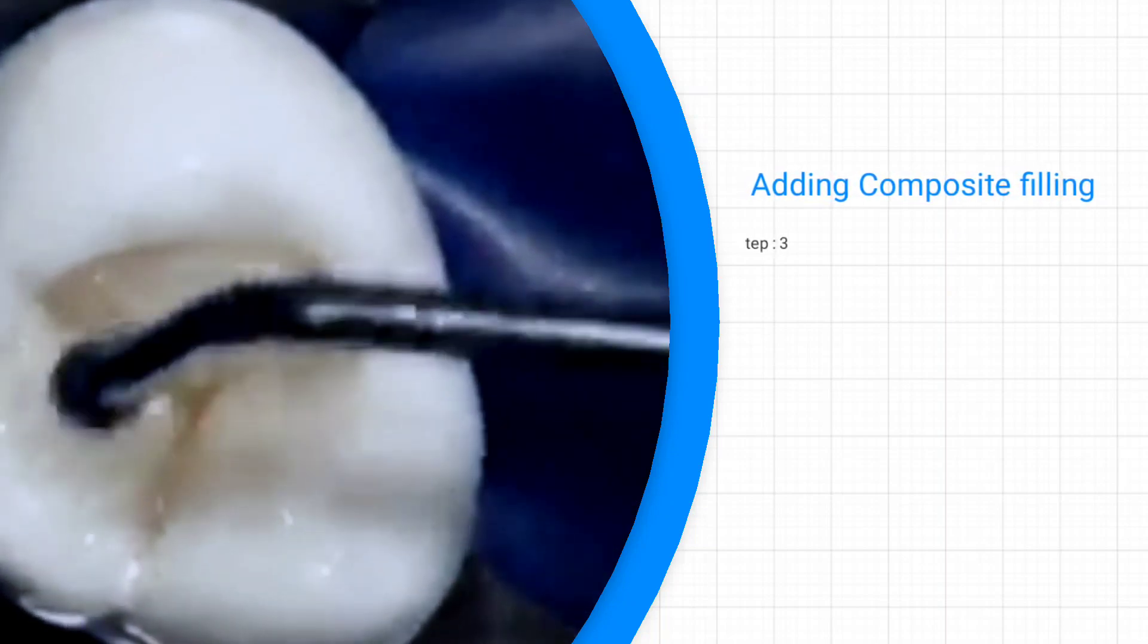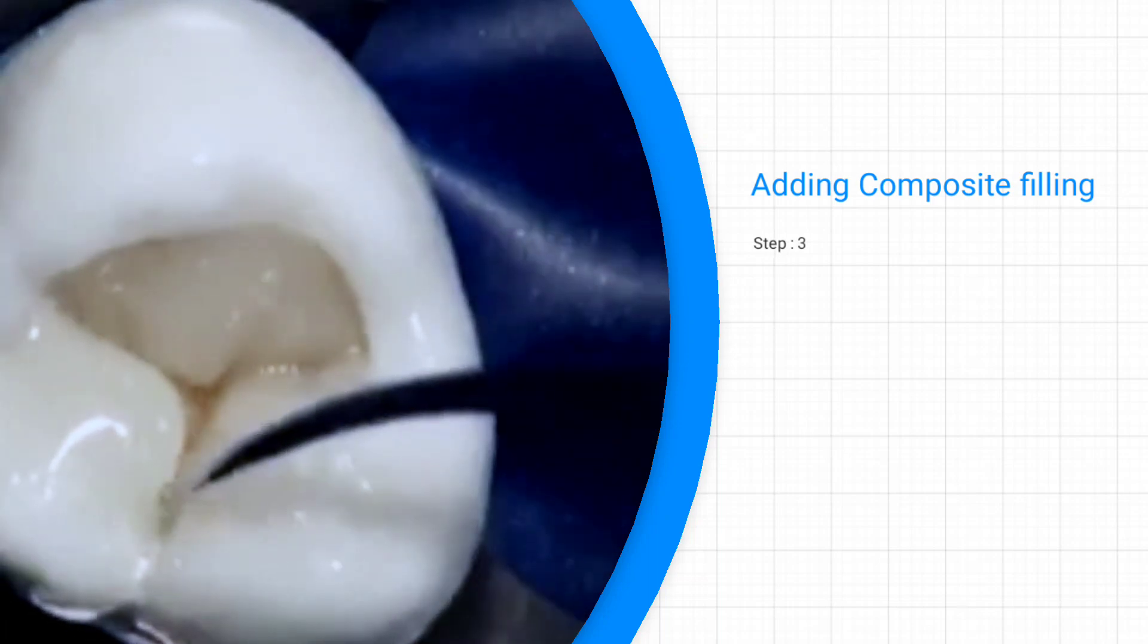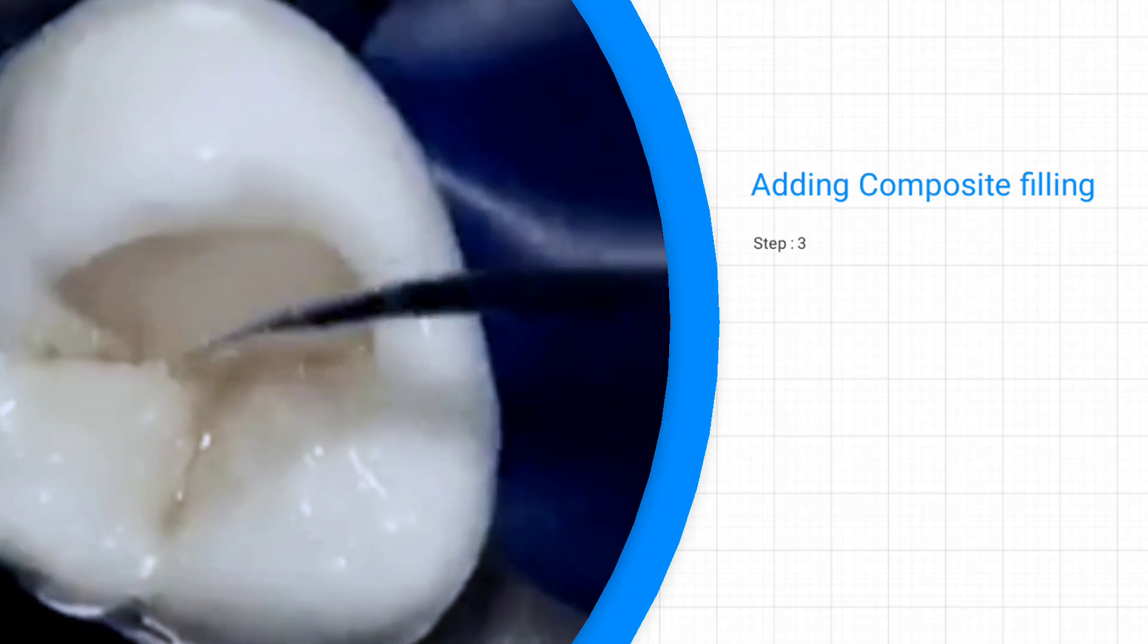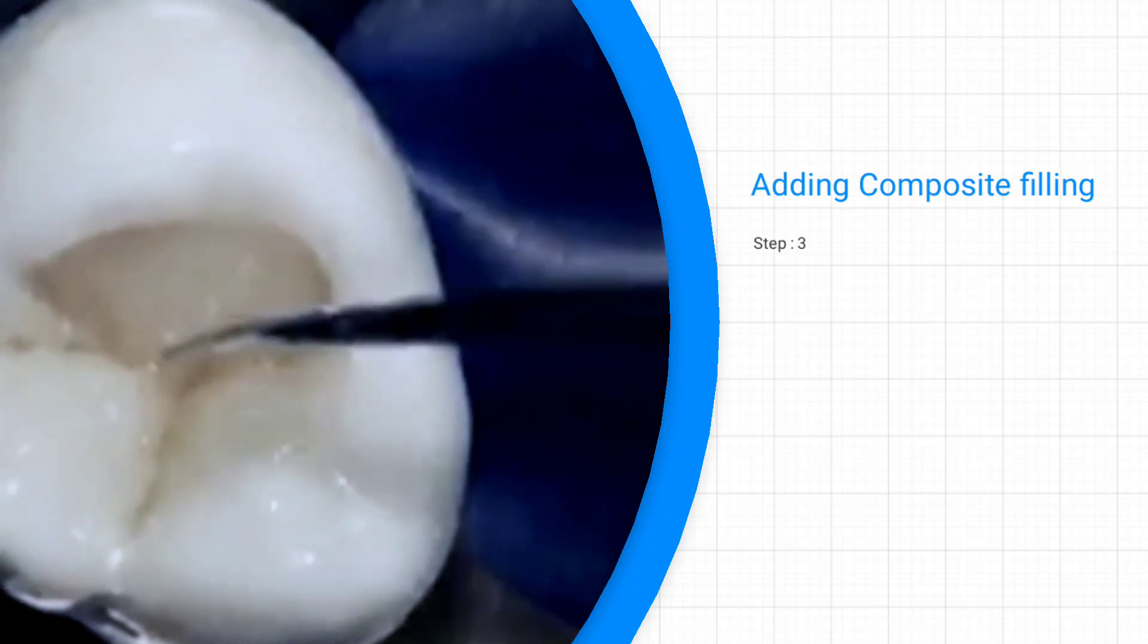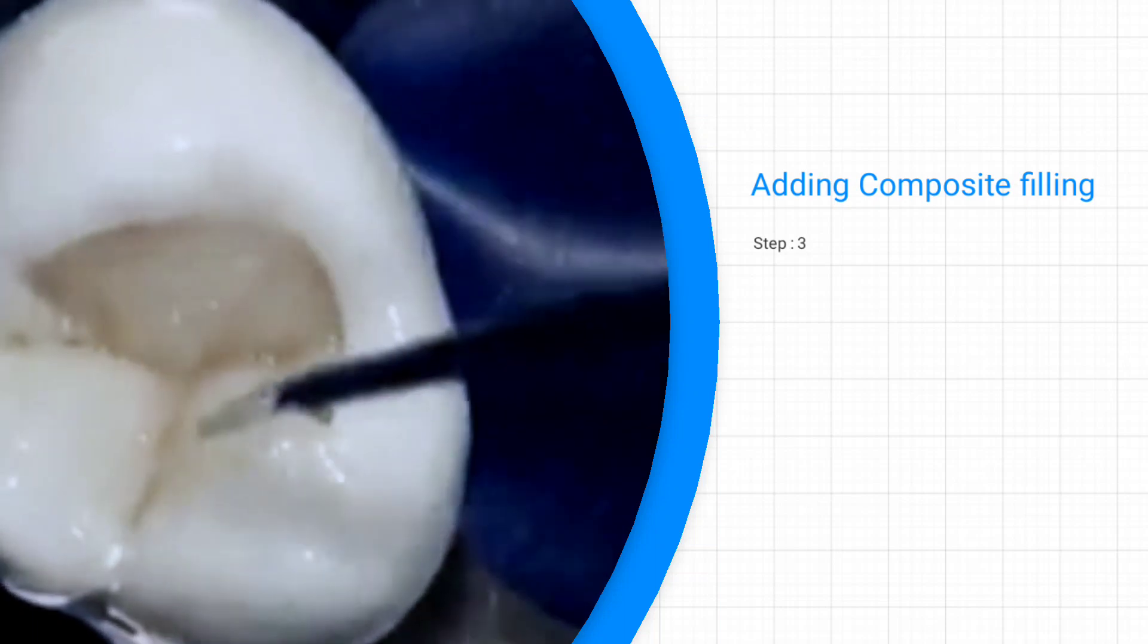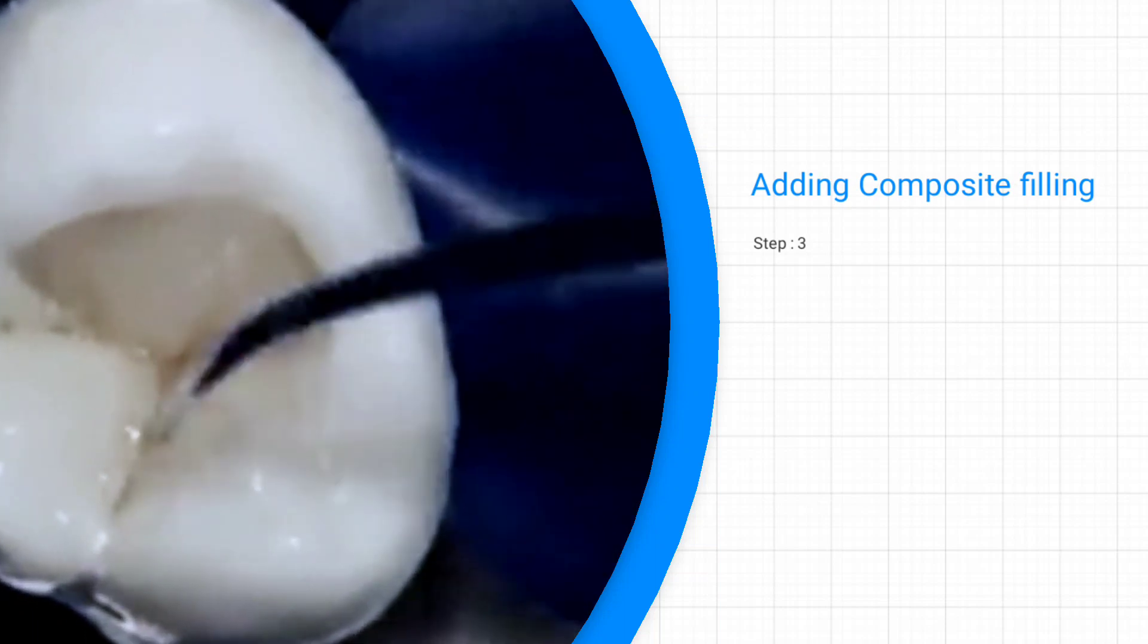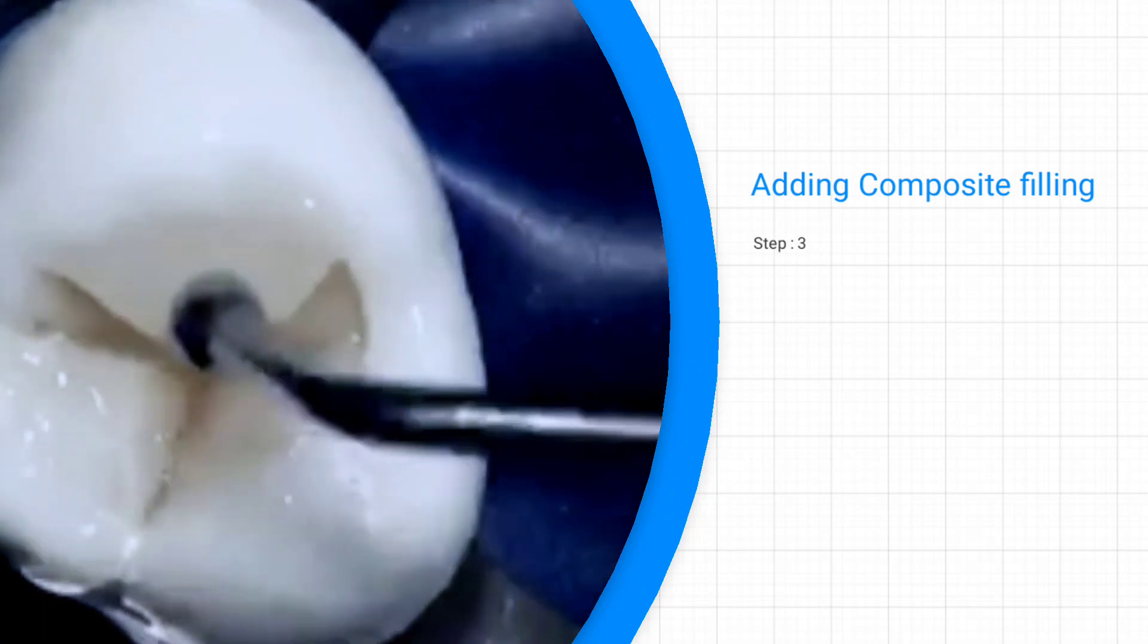Even though the placement of tooth bonding has been completed, it's still very important to check the patient's bite. You need to evaluate how the patient's teeth come together or whether or not the restoration you have just placed interferes with this motion. To do this, you need to place an articulating paper, or you can also take a thin strip of carbon paper between the patient's teeth.